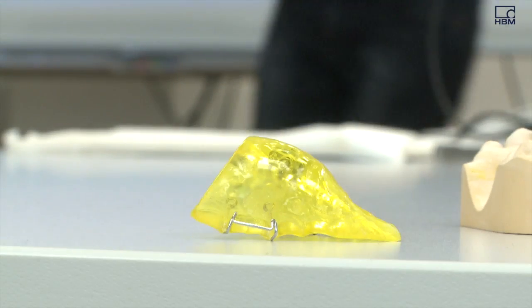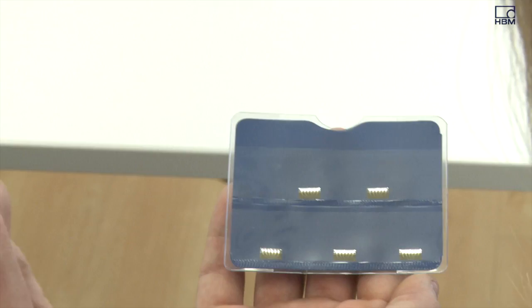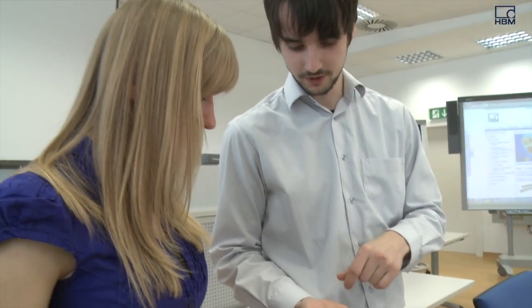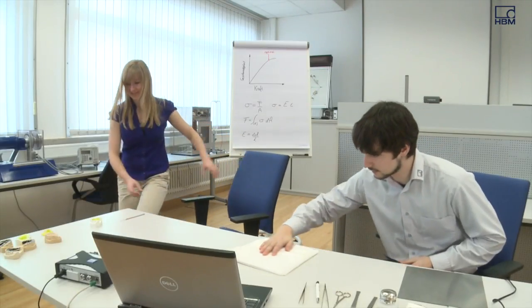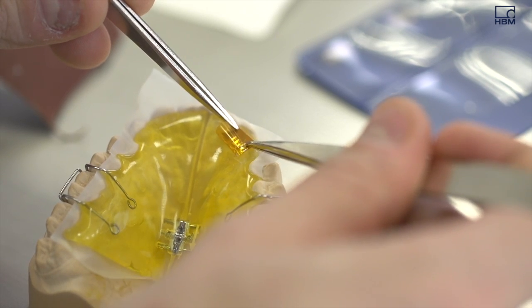Lynn Beesk utilizes HBM strain gauges for the braces sensor system. We have just installed the strain gauges. They measure strain occurring on the braces. The measured signal is evaluated with an amplifier, and the results can be viewed using HBM's CADMAN data acquisition software.